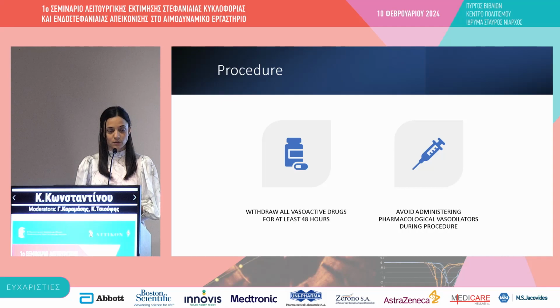We have to be careful about making sure our patients stop taking the vasoactive drugs for at least 48 hours before coming in. And we don't administer any vasodilators, so we don't give a radial cocktail or verapamil, and we don't give nitrate during the assessment.